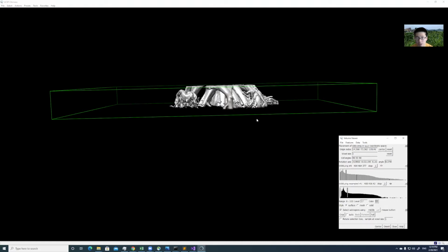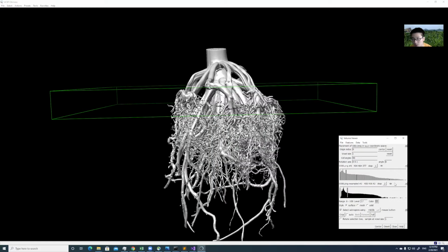And so this basically results in an additional volume being created, so an additional model. You can see that there's a top one right here, and this is the original volume. And there's a bottom one right here, which is made up of the crop volume. And this crop volume is just this soil plane region that we rotated a bit that we can now play with independently.